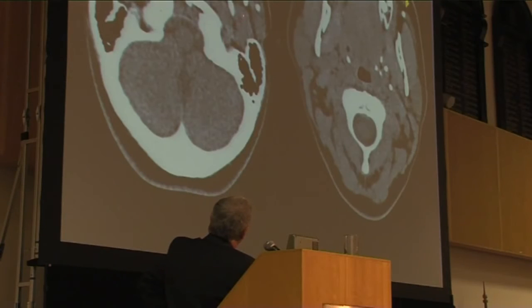We use external lithotripsy with low energy, 10,000 shockwaves per session, 3 sessions for every patient. And a few case presentations. This stone before treatment, after 3 sessions.